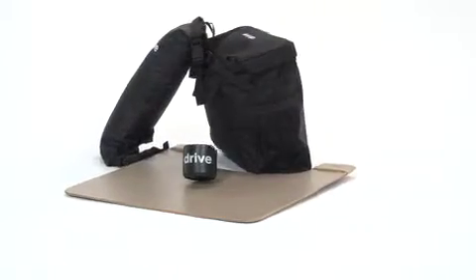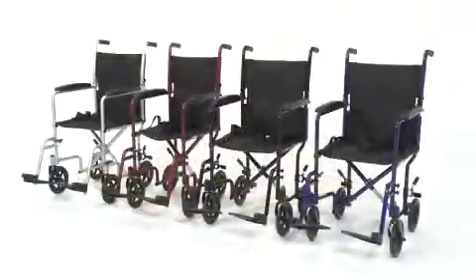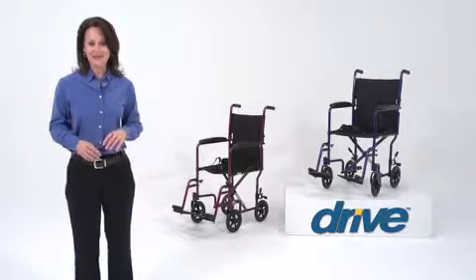tray, oxygen tank carry bag, and carry pouches. The chair is also available in four attractive color options. You can always count on Drive Medical to bring you convenient and innovative lifestyle solutions, now and for the road ahead.